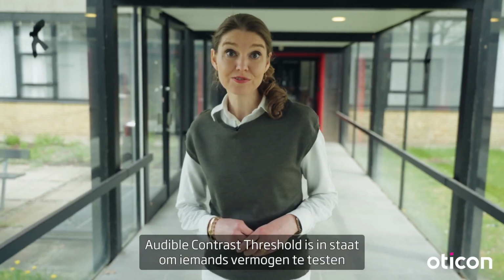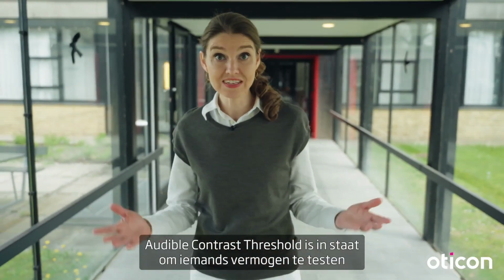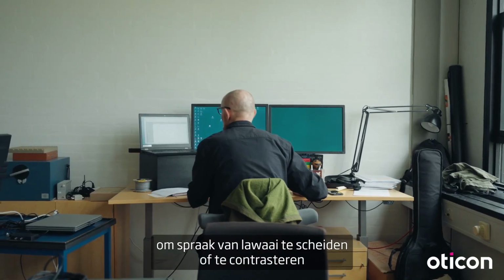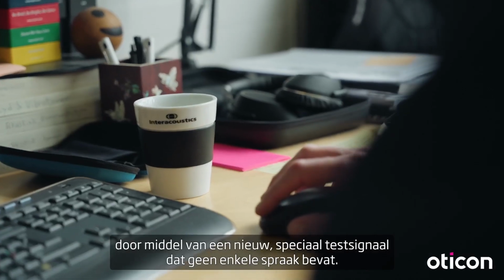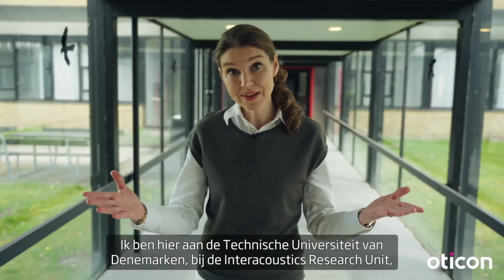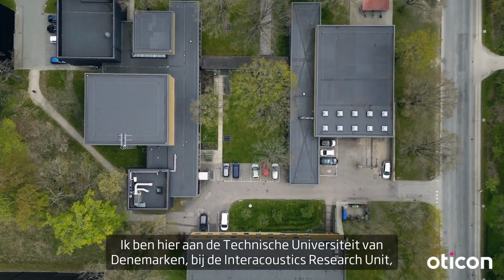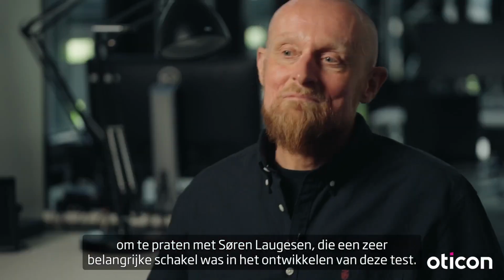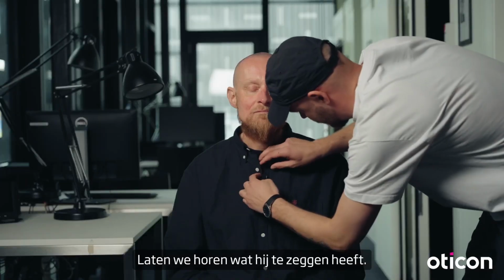Audible contrast threshold is able to test a person's ability to separate, or contrast if you will, speech from noise using a special new test signal that does not contain any speech whatsoever. I'm here at the Technical University of Denmark at the Interacoustics Research Unit to talk to Søren Laugesen, who has been a founding figure in developing the test. Let's hear what he has to say.